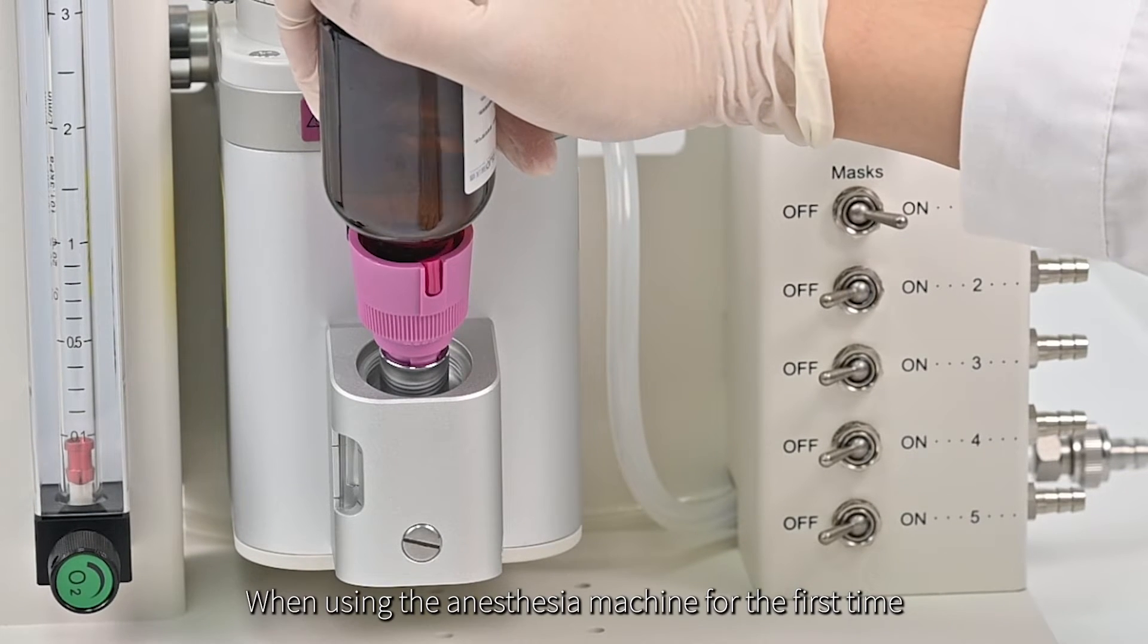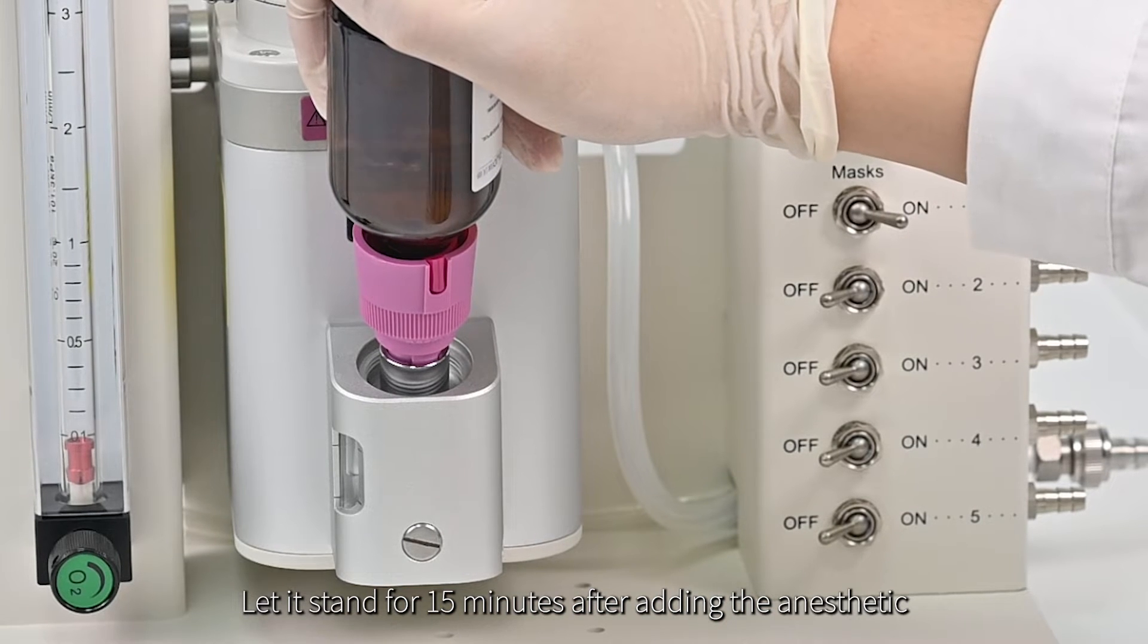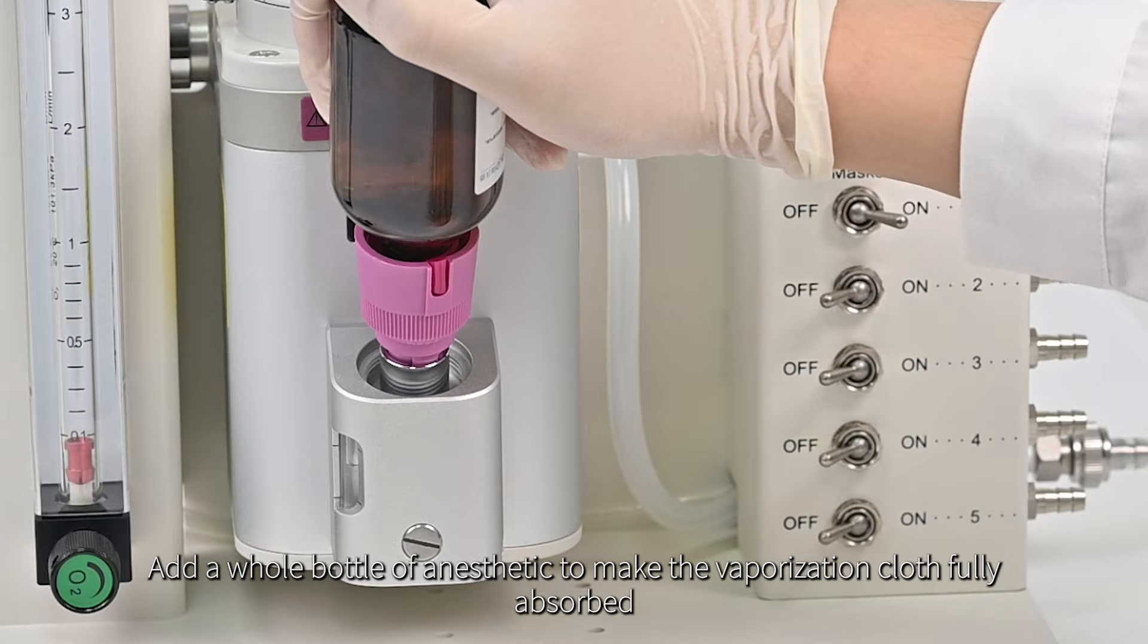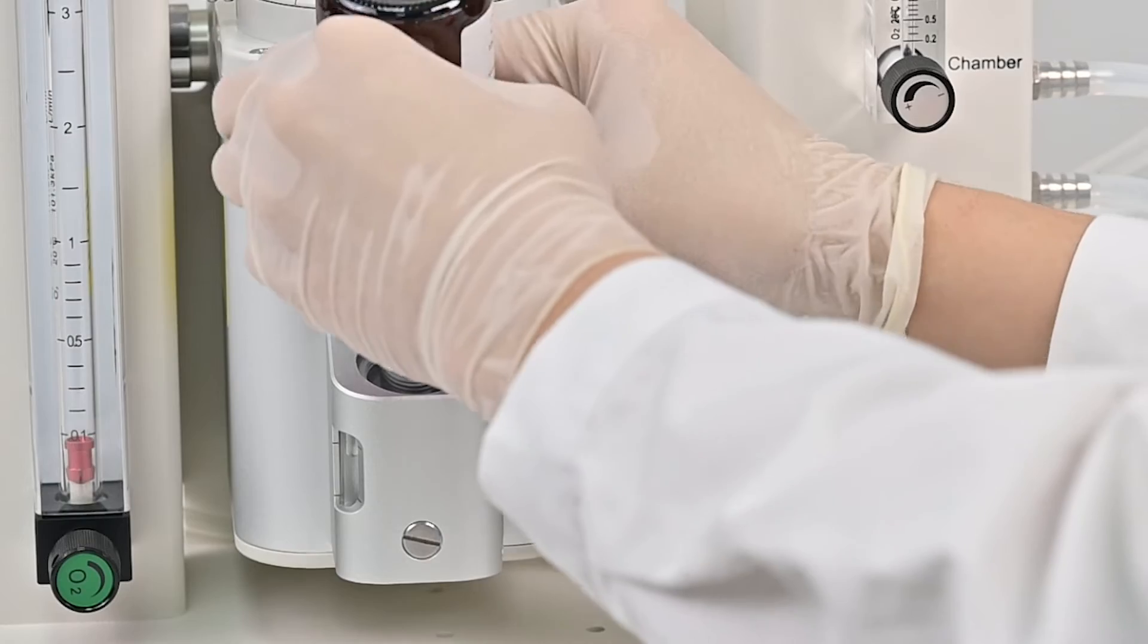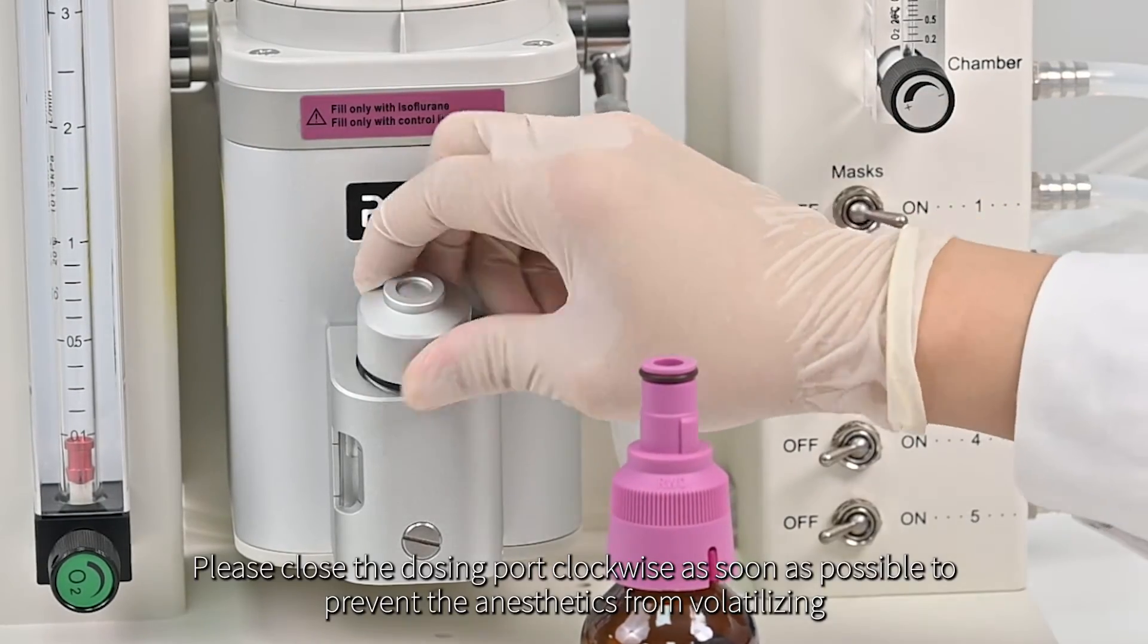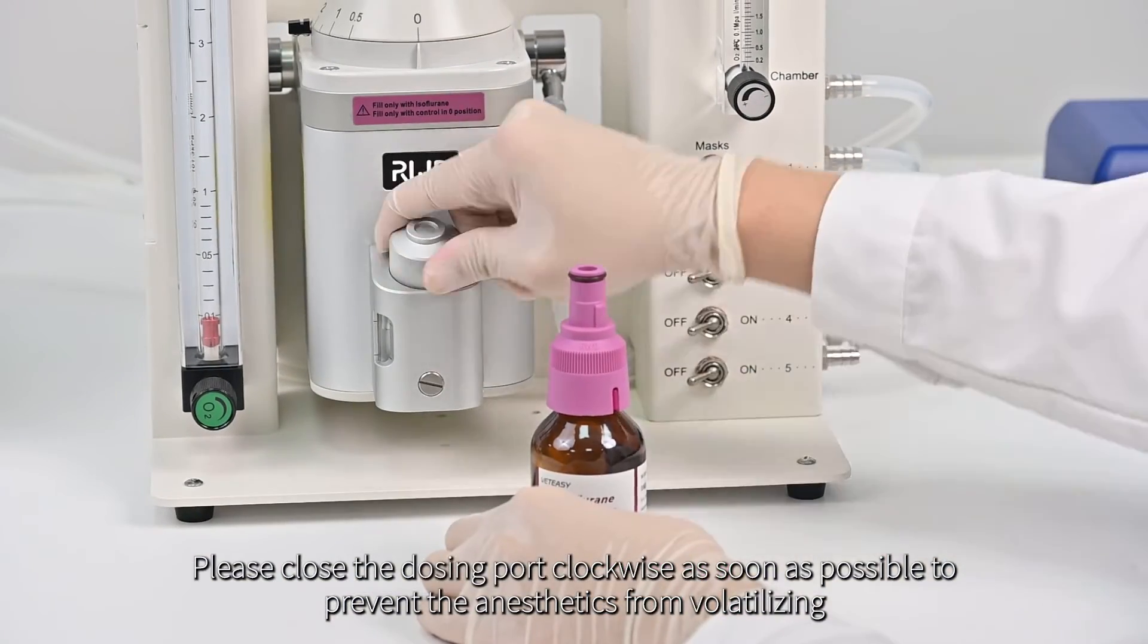When using the anesthesia machine for the first time, let it stand for 15 minutes after adding the anesthetic. Add a whole bottle of anesthetic to make the vaporization cloth fully absorbed. After adding, please close the dosing port clockwise as soon as possible to prevent the anesthetics from volatilizing.